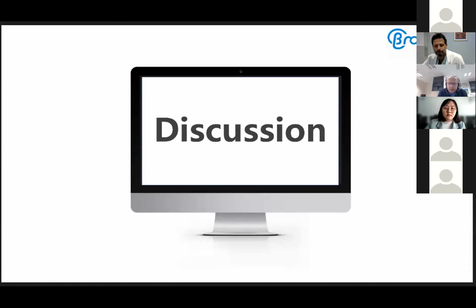Great, great. So Stefano, thank you for your presentation. Just a quick question from Spain. Sí, Pablo. Yes, Pablo. I saw your nice trifurcation case. So it makes sense, of course, to start with POT, but in which wire do you send the POT in? Because it could be the main vessel, so the LAD, or it could be the central wire, just to make a symmetrical opening. So what are your thoughts on this?